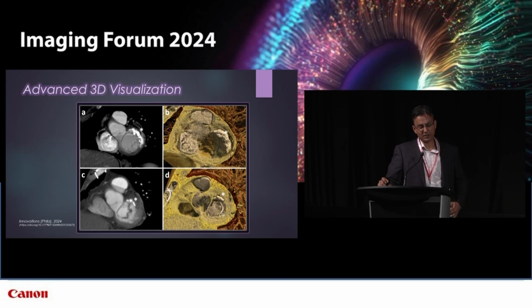And the image on the bottom shows the repaired valve, the dramatic decrease in the mitral annular calcification that they emulsified. And if you look closely, which you can't see on the MIP image, there's the annuloplasty ring that's actually sitting at the mitral position as well.